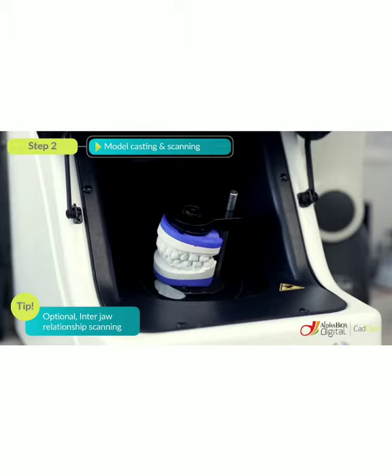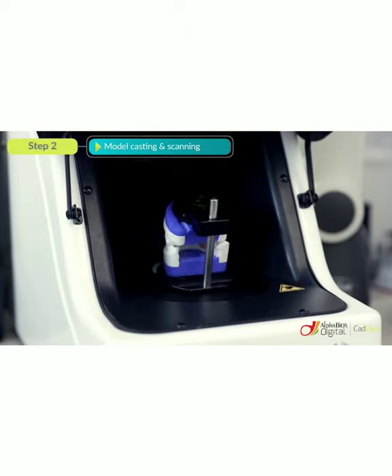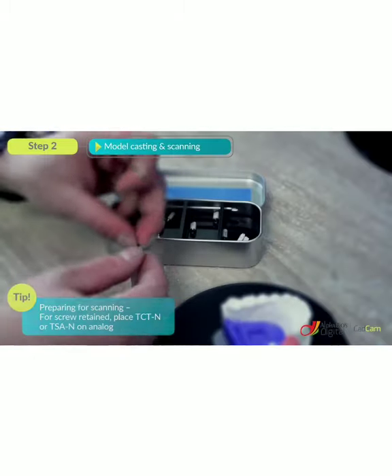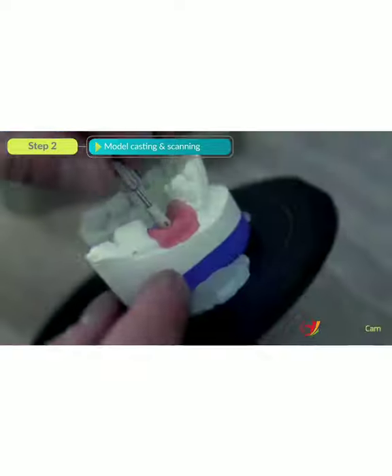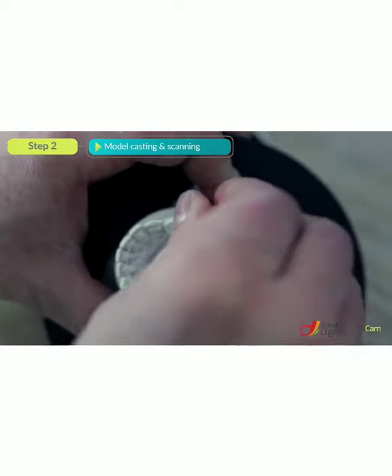Optional, interjaw relation scanning. Preparing for scanning, first screw-retained, place TiBase or analog. This one is the scan body.